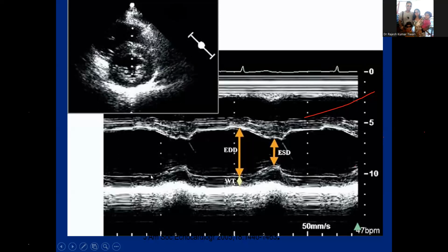Endocardium. Correct. So it's a very small, thin line over here, and you see it only if you look very carefully. This is a zoomed-up, very magnified image of the endocardium. So we do not measure the endocardium and myocardium separately. We cannot differentiate them. These are very small, thin lines. Okay.